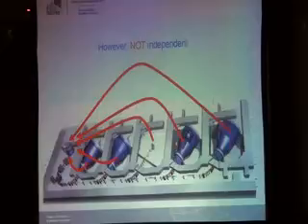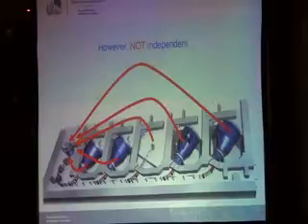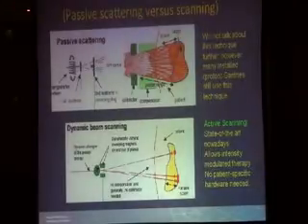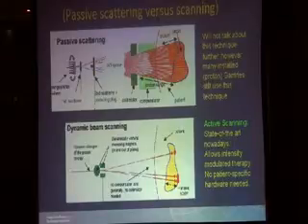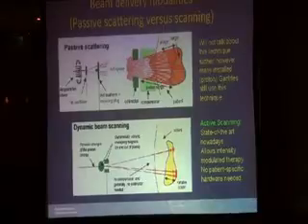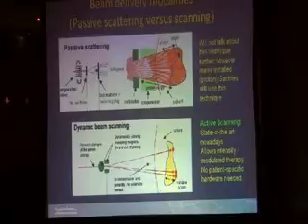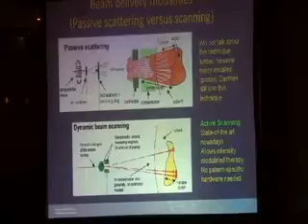And coming to the proton therapy. The proton therapy is a very good machine, but it is very expensive and needs a lot of space in order to install. You either use it as a passive scatter or by pencil beam scanning. This is going on right now, and the compact system of the proton therapy makes it a little bit cheaper, and this has made many centers install the proton right now.